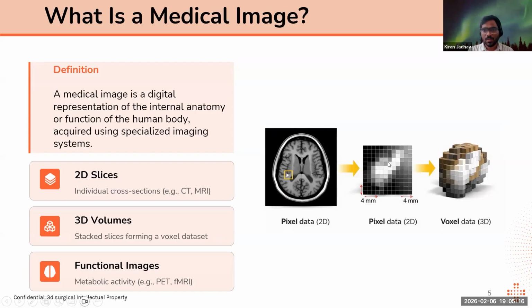Here in this image, you can see these are the darker pixels, these are slightly dark, these are the bright pixels. So each and every pixel has an intensity. We will talk about these pixel values deeper in the upcoming slides.